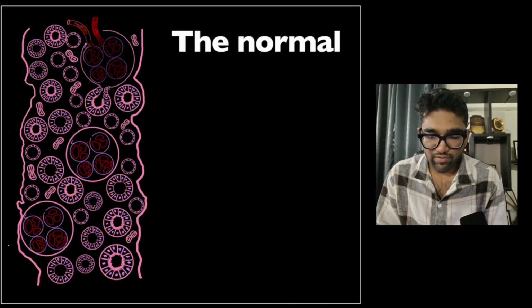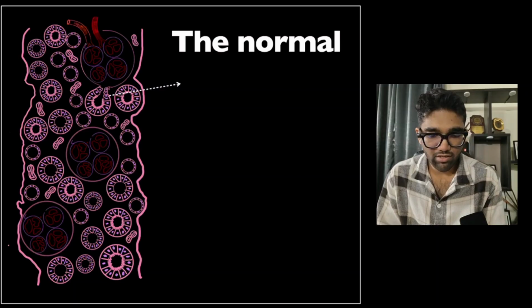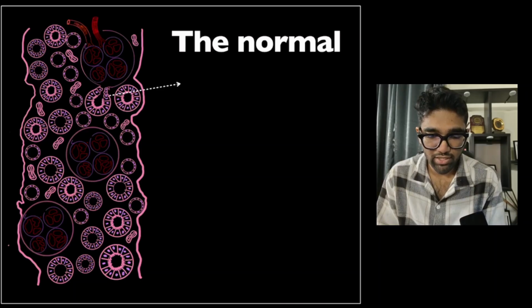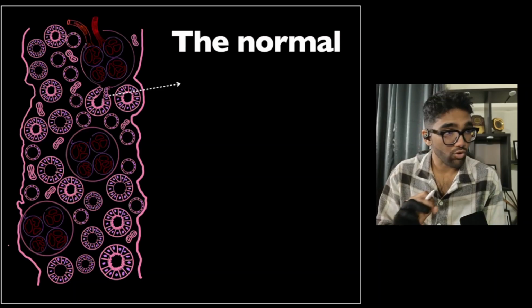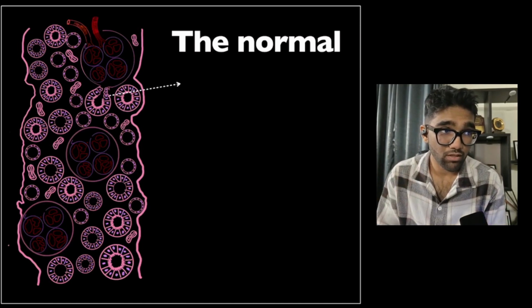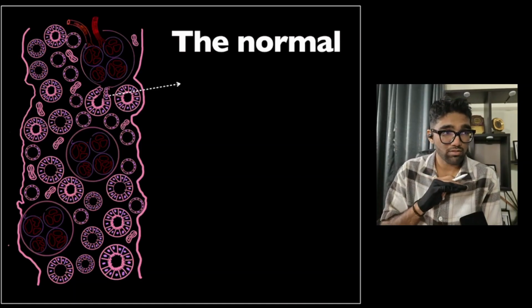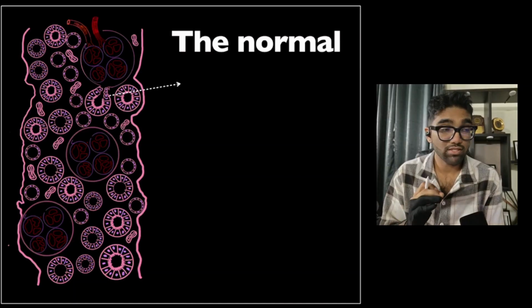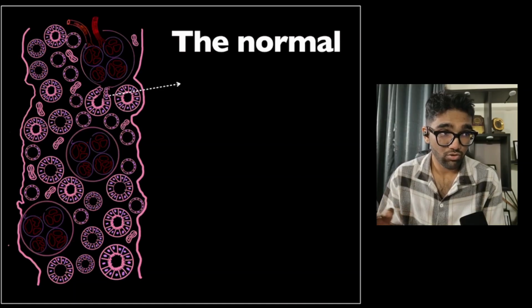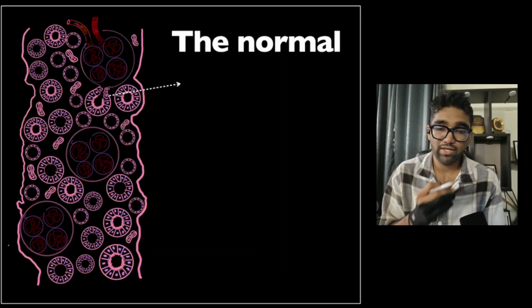Along with that, we have some other things. So we'll just shade out the glomeruli. Once you've shaded out the glomeruli, we find that there are a lot of circular structures within the interstitium of the kidney, and they are obviously the renal tubules. Although I've used a different schematic for the entire nephron, once you take a two-dimensional cut section through those nephrons, the tubules of different nephrons get cut at different levels. As a result, you get a hodgepodge of these different types of tubular cut sections when you look at it under the microscope.